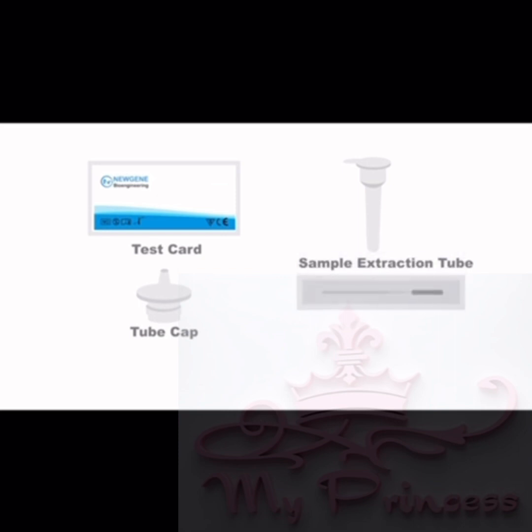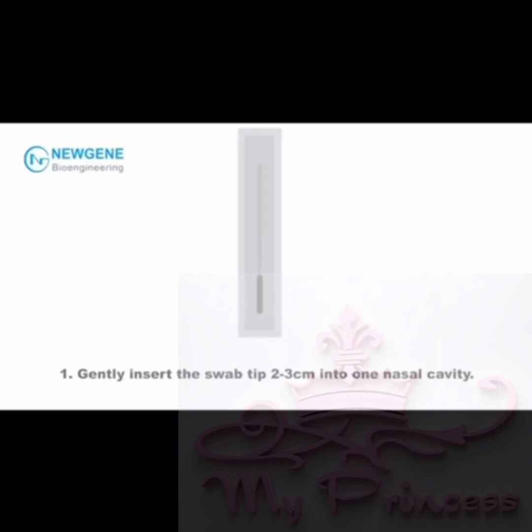Product Composition: Test Card, Sample Extraction Tube, Tube Cap, Sampling Swab.